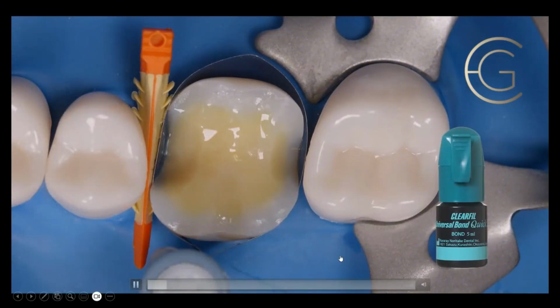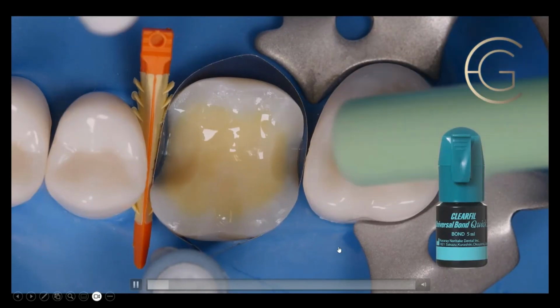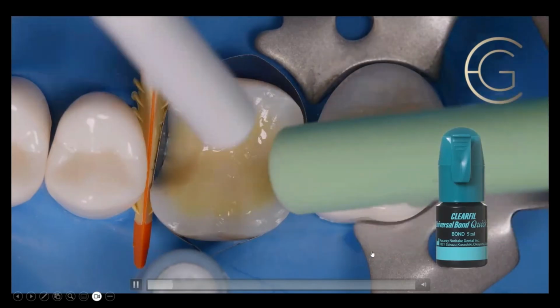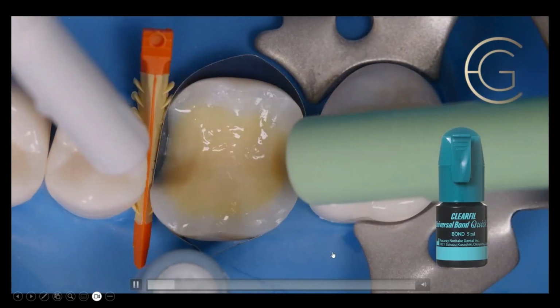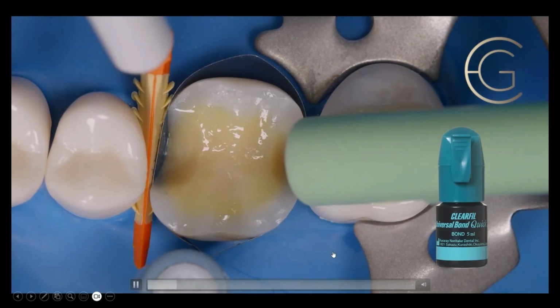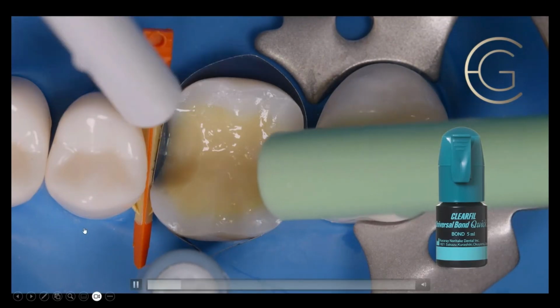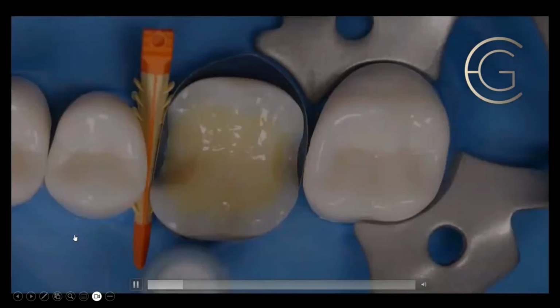All the universal bonding agents require you to gently but thoroughly dry. This is water-based, but you have to gently but thoroughly air dry this, and it takes about 20 seconds. You should never blast your bonding agent. Never blast. It shouldn't be on high, like the button all the way down. It should be a very gentle stream. And this is live. This is real time. I didn't edit this out.